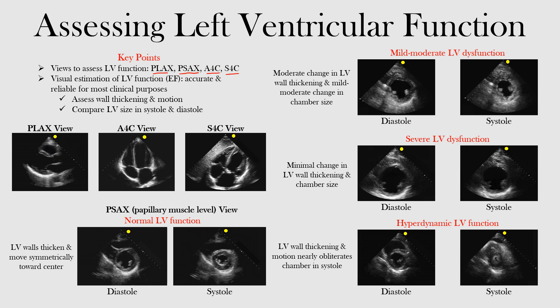Let's look at these views. We have the parasternal long axis view, in which we can see the left ventricle here. Then we have the apical four chamber view with our left ventricle cavity, and we also have the subcostal four chamber view where you can see the left ventricle as well.